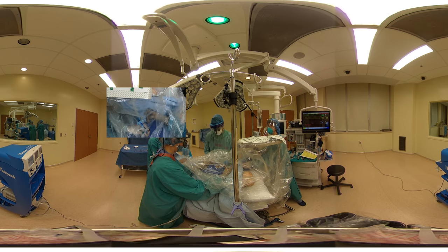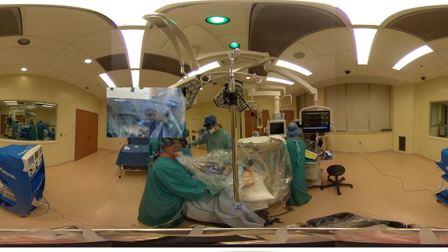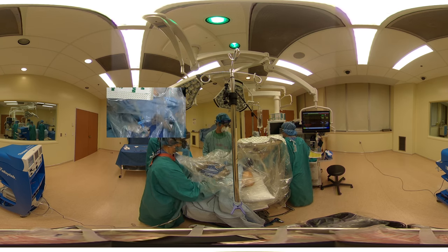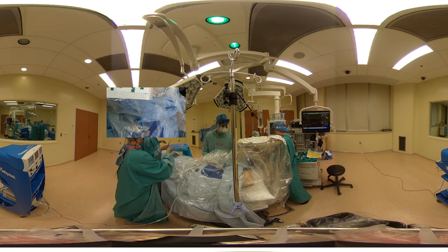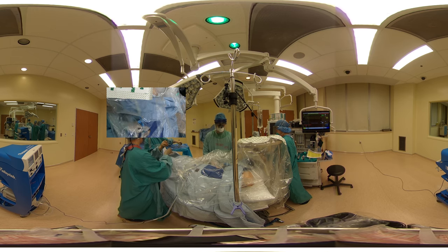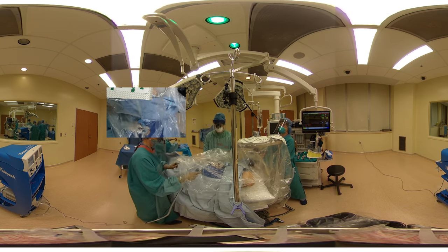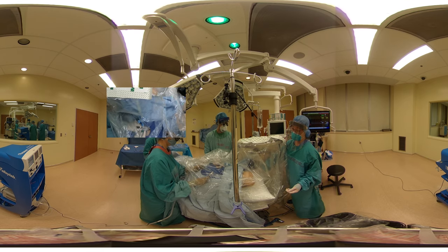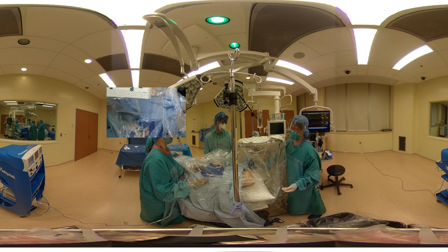Excellent. We'll now induce general anesthesia with paralysis. John, you're going to go off to sleep. You've got the cuff, you've got the tube — hold it in place. We're going off to sleep now, John. It's going really, really well. Propofol in. And we can now secure the tube with sutures and with a Velcro tie. We'll have to be very careful when removing the tent to minimize spray.